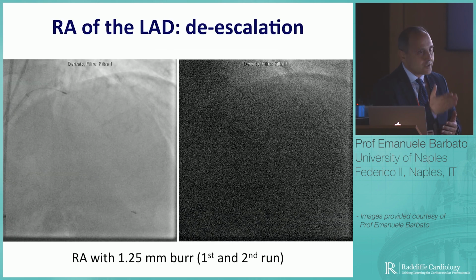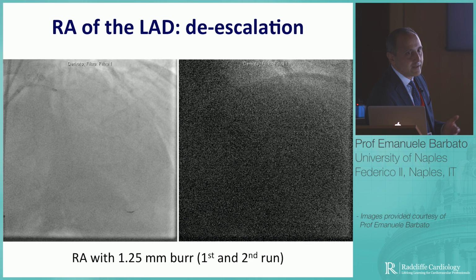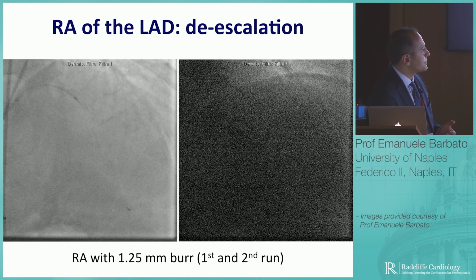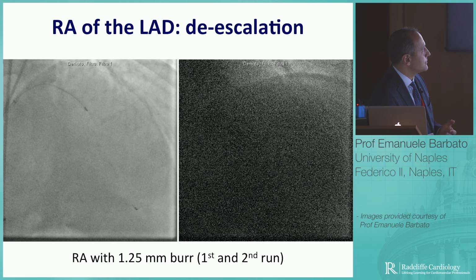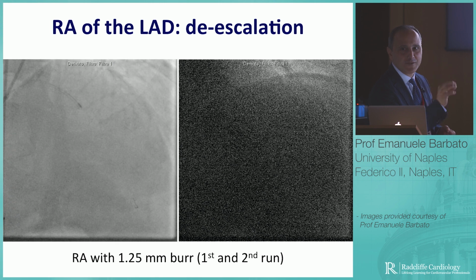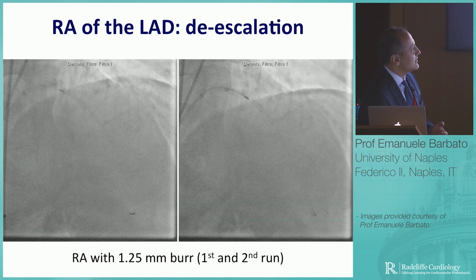I think the suggestion came from you. De-escalation, 1.25 millimeter burr. Okay, let's do that together. First run. Do you notice that now the pecking motion has become faster? Okay, second run.